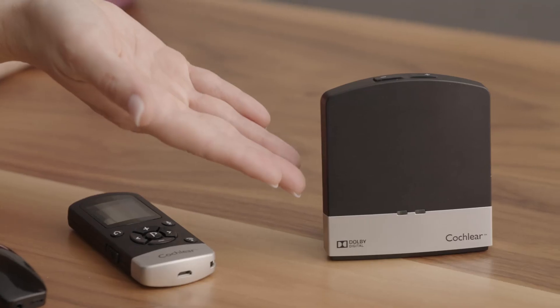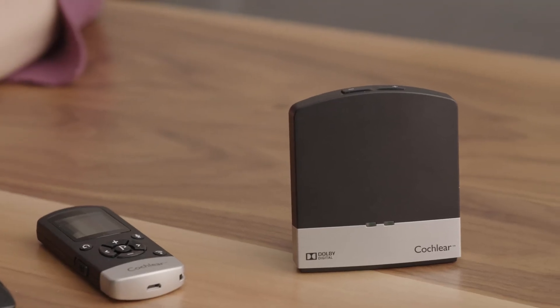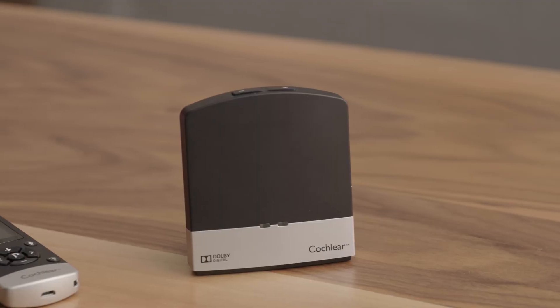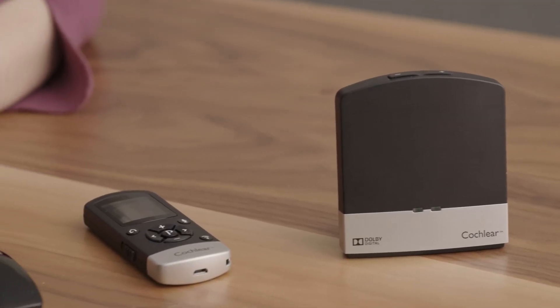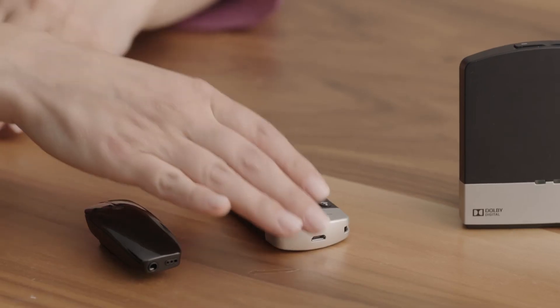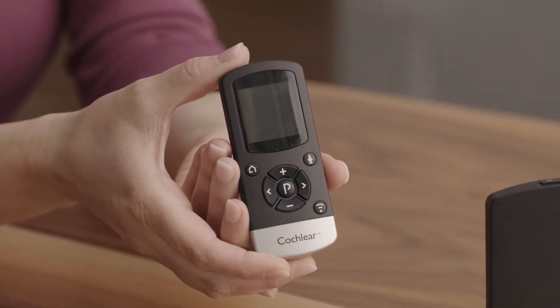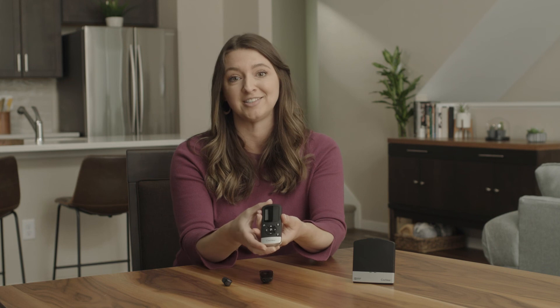The Cochlear Wireless TV Streamer is great for households where more than one person may be watching TV. The TV Streamer allows you to hear the TV directly through your processor at your own comfortable volume, while other viewers in the room listen at their preferred volume, or not at all. If you're not utilizing the free Cochlear Baja Smart App with a compatible smartphone, you'll want to use the Cochlear Baja Remote Control 2 to adjust the volume, programs, and activate streaming from wireless devices.